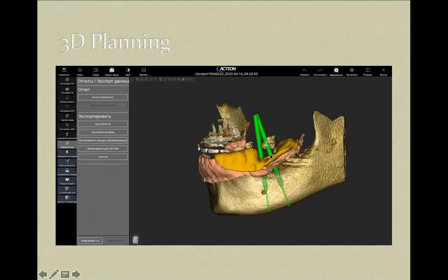And by the combination of an intraoral scanner and the CT scanner and your virtual planning, you can prepare a template which will show you the direction of your implant related to the further prosthodontic rehabilitation. Again, that's just two words because I can talk about that for hours, maybe for days. Those are separate master classes.